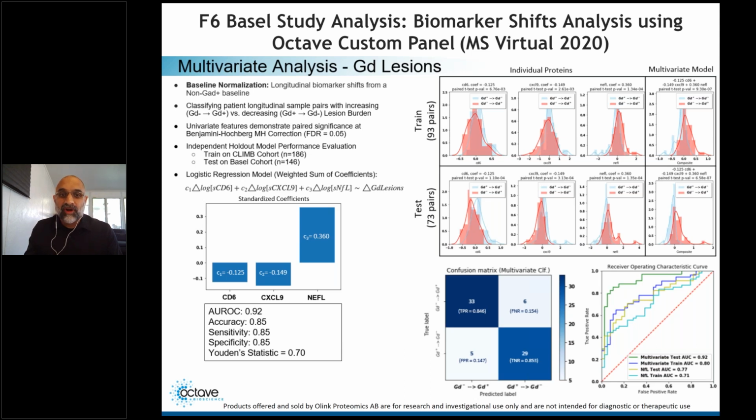And so then we're able to take the biomarker levels at each of those 2 time points on an associated serum sample, and rather than using the absolute concentration, we use the calculated delta for those biomarkers to see, can the shift in the biomarker level provide association with this endpoint? And we see, in this case, even stronger performance than using the absolute concentration.